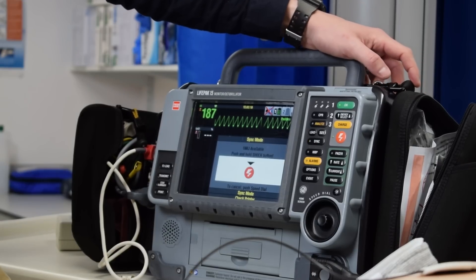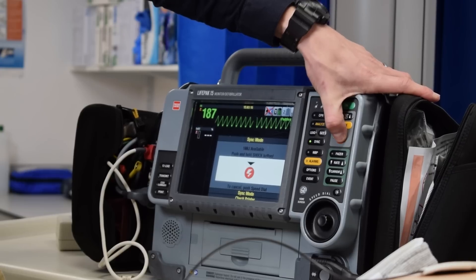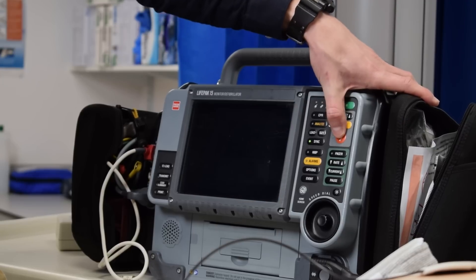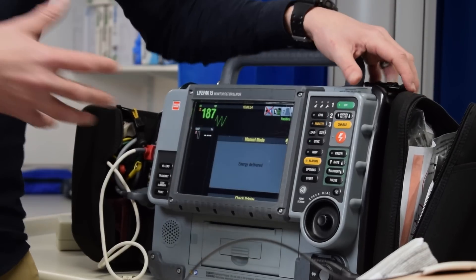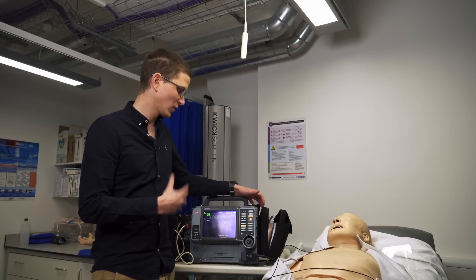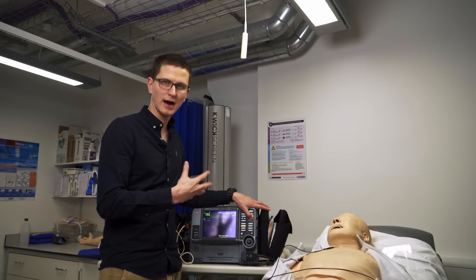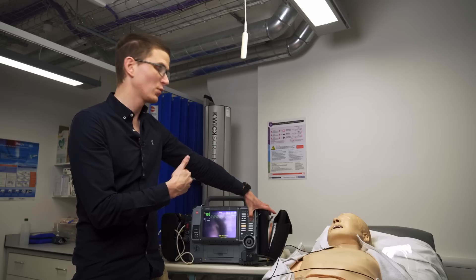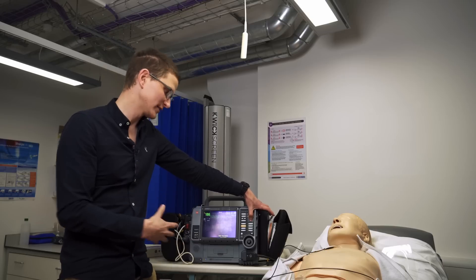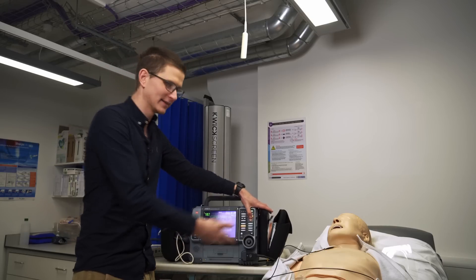The important bit here is that we need to hold the button down. I'm pushing and it's not actually shocking — and there we go. You see what happened: I push the button and push the button and it's not shocking, and some people can panic quite a bit. But what actually needs to happen is we say it's safe to shock, patient's clear, I'm clear. We need to hold down the shock button, and then when the monitor feels it is safe to shock, it will shock. So the machine is deciding when to shock; we're deciding when it's safe to allow the machine to shock.